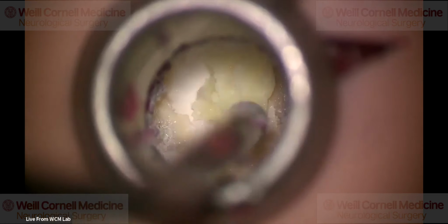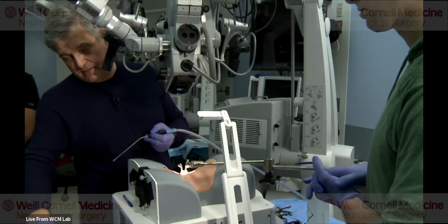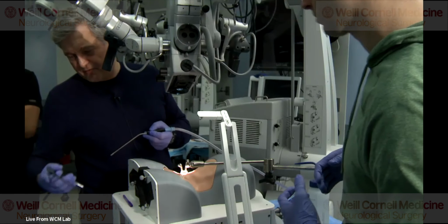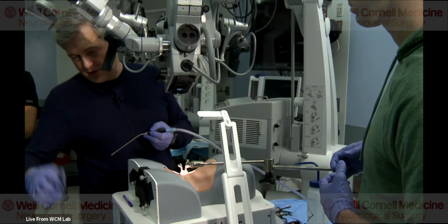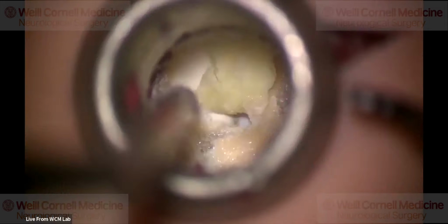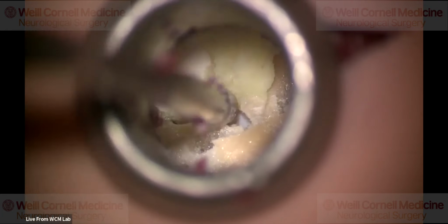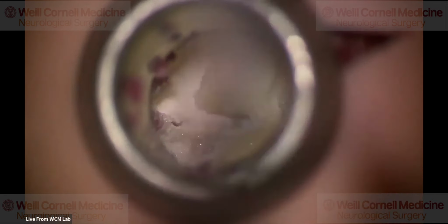So now I thin down the bone on both sides, and I take a 2 millimeter Kerrison and start taking some of the bone up and down. So the dura is here, the bone is here. I take some of the bone here, and then you can suck up the bone, or have the assistant take it. So I found the insertion of the ligament, and that ligament is loose.